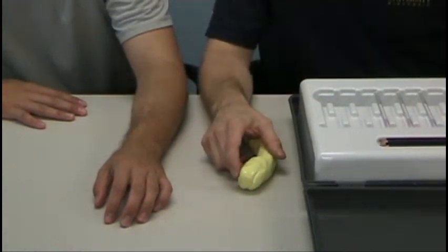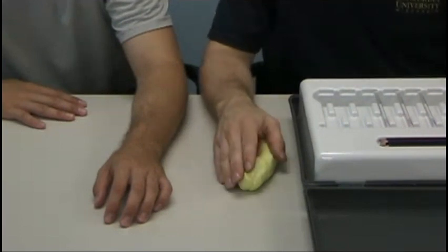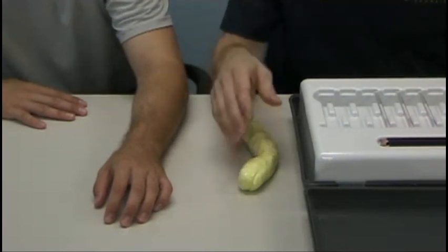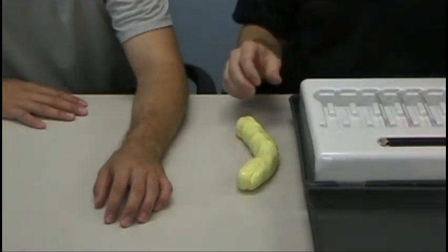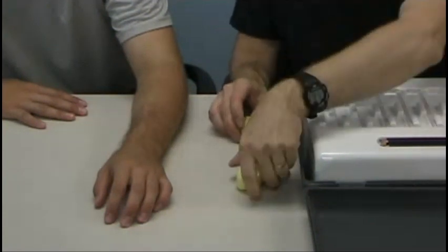In this video, I want to introduce the Simms-Weinstein monofilaments for testing sensation. Sometimes it's called the touch pressure threshold test, but the actual name of the assessment is the Simms-Weinstein monofilaments.